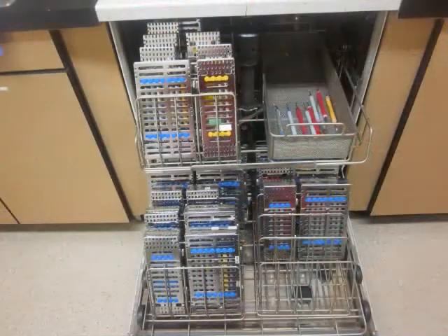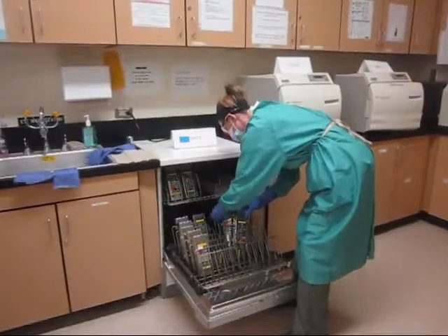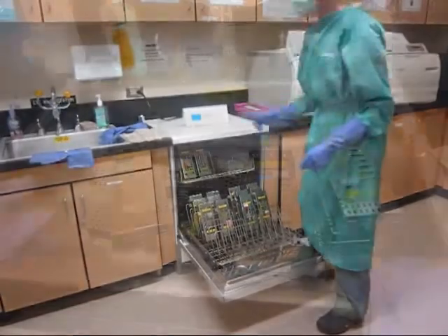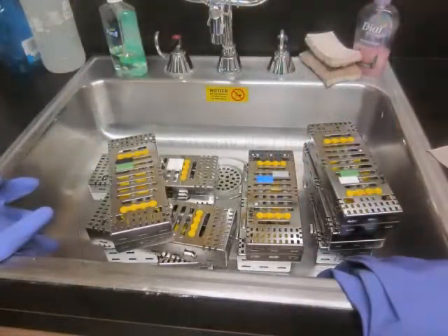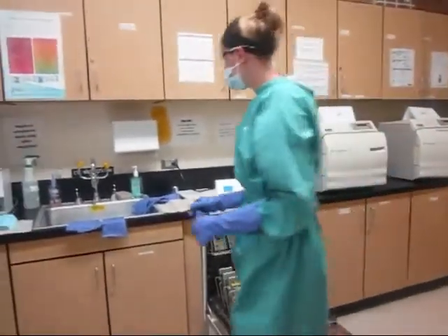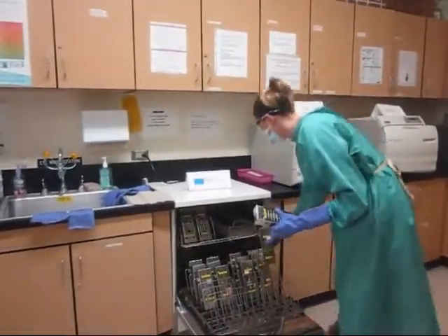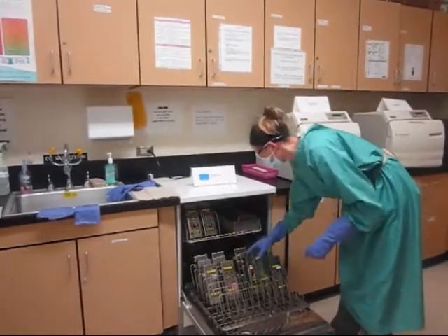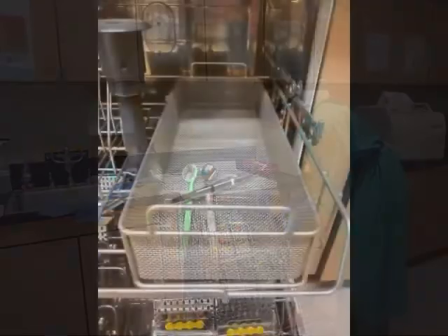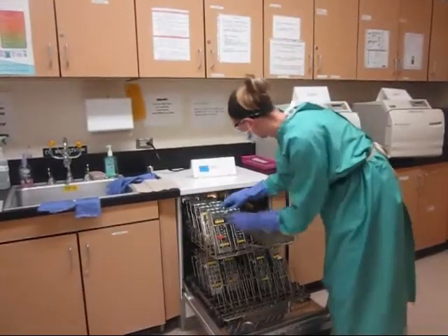Each cassette leans towards the back of the Miele. If cassettes are cluttered or improperly oriented, disinfection will not take place. You may not leave cassettes in the sink unless the Miele is in a cycle. Contaminated cassettes should only be placed in the Miele or sink. Some instruments may be placed in the mesh basket for disinfection, but Nadine avoids this because of the dangers of grabbing exposed sharps.